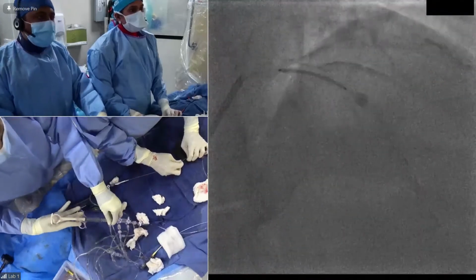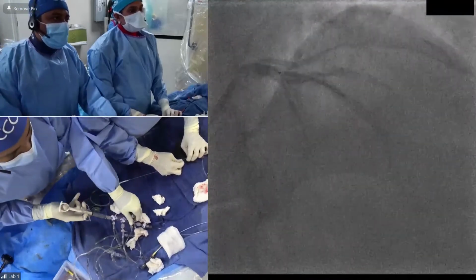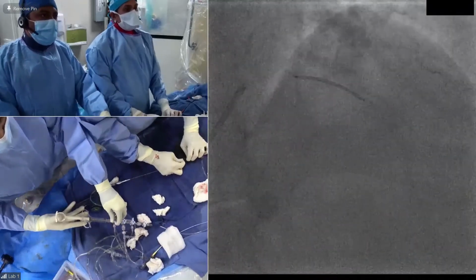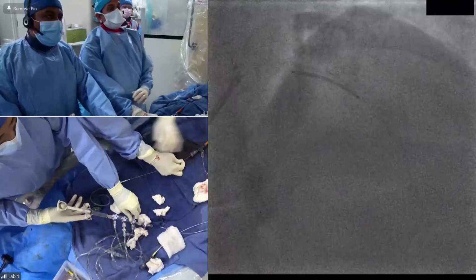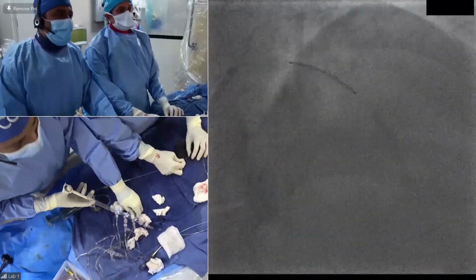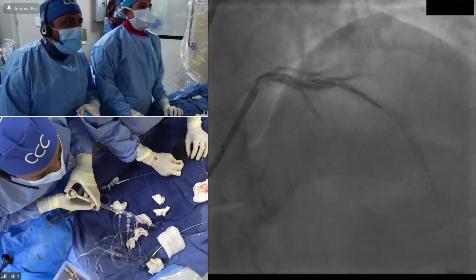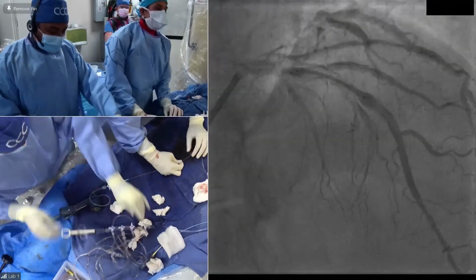It's very good. Advance a little bit. Okay, good. Yeah, it was good at the beginning. I think that's what we want. Just end it up in a natural position. Let's go. Excellent. Exactly where you want it.